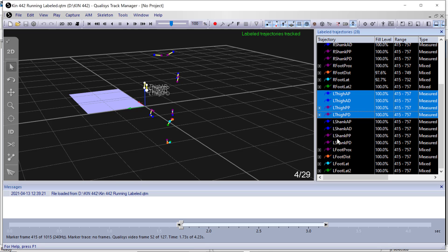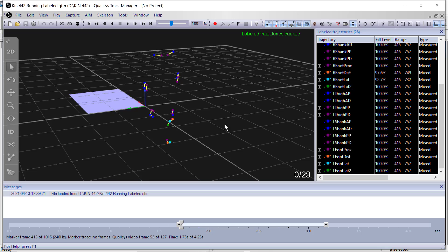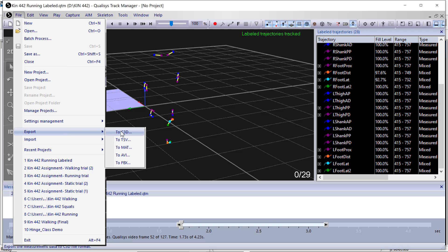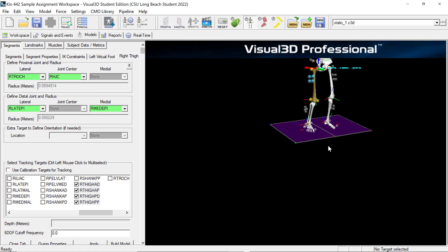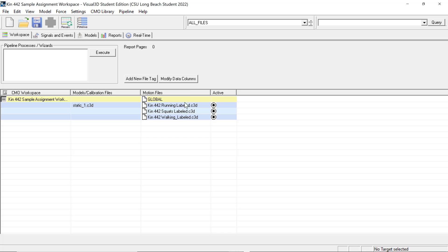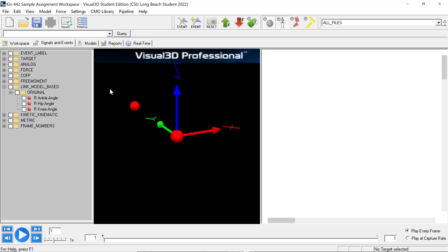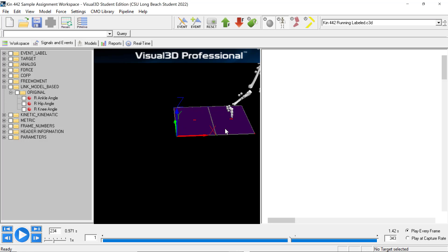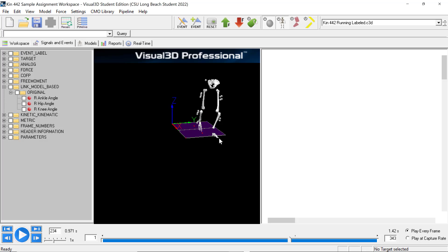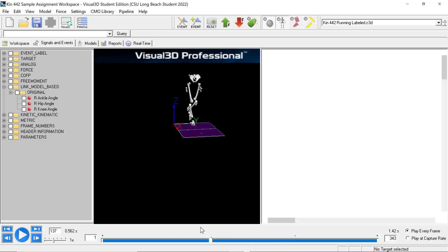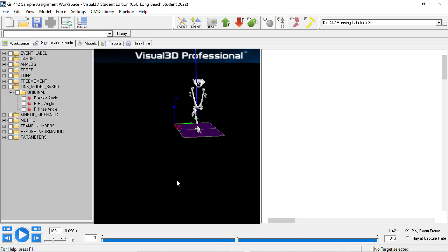Once everything is matching, you'll do the same process of exporting to C3D, and then your file will be ready to go. Once it's ready, you can upload it in Visual 3D, and in your workspace you'll be able to apply your model template to your Visual 3D file — like the one shown here — and see what's going on with the motion itself.